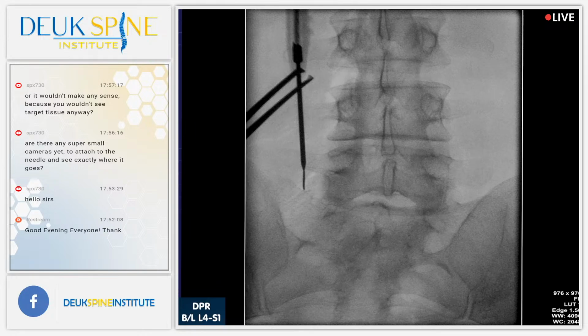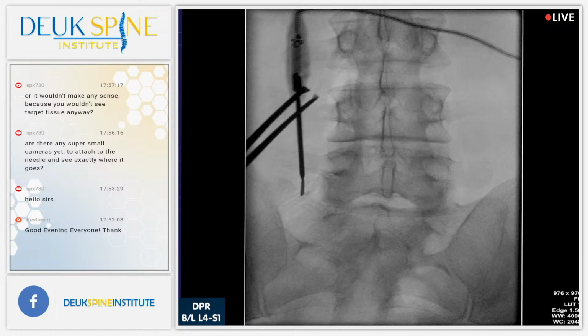All right. So this is really a good location right here. It's right where the pain nerve should be. But I'm not right on the bone yet. I'm still at the fascia. So there is the last burn on the left side. It's a nice burn. I feel the bone. I feel the architecture of the bone. And I'll go to the other side. I'm going to go to the right side at this point.